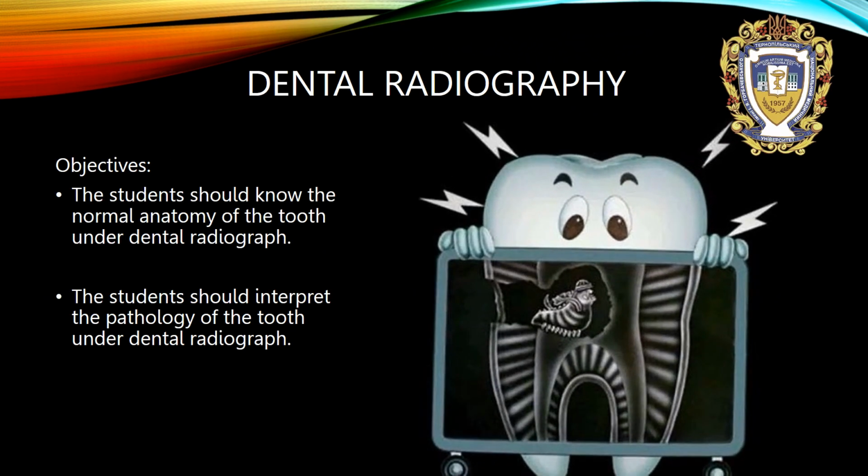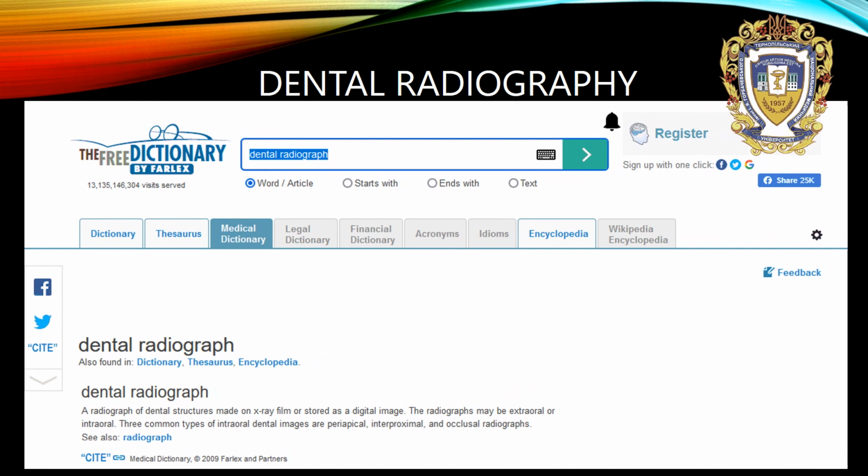Objectives. The students should know the normal anatomy of the tooth under dental radiograph. The student should interpret the pathology of the tooth under dental radiograph. Let's begin with terms.